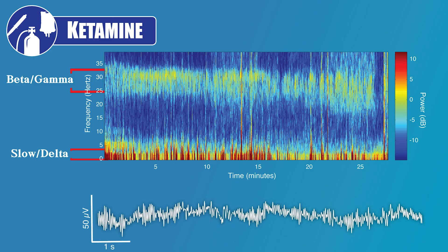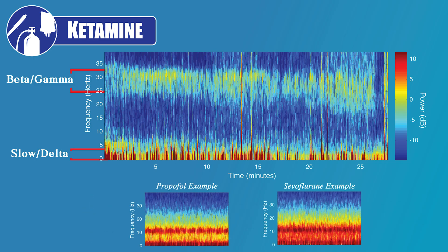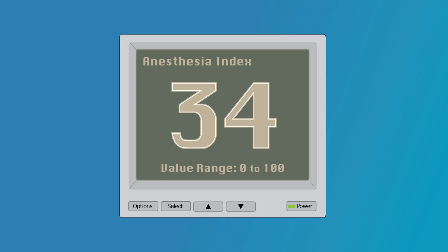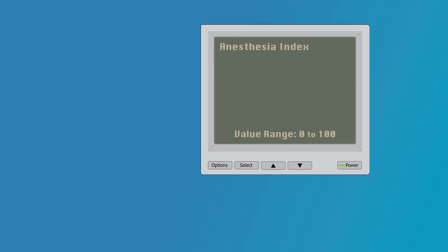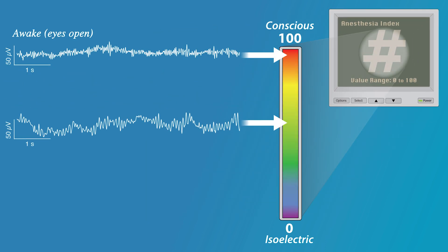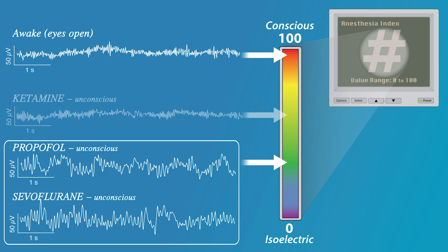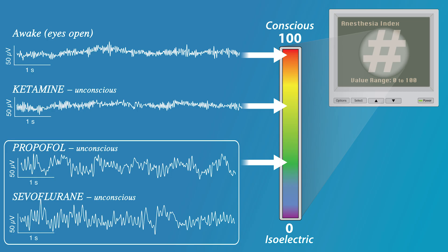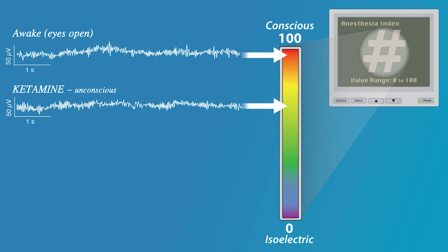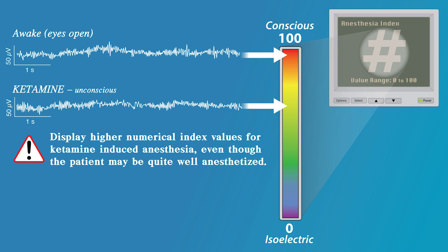A slow delta oscillation is also present in the EEG during low-dose ketamine delivery. However, compared to propofol and inhaled ether-derived anesthetics, this slow delta oscillation is less regular in appearance. Processed EEG-based depth-of-anesthesia indices tend to have problems when ketamine is administered. These indices tend to associate low-frequency EEG patterns with a more unconscious state. While this is true for drugs like propofol and sevoflurane, it is not true for ketamine. By the nature of how ketamine affects the brain, it produces high-frequency EEG activity when it is working to alter consciousness. The processed EEG depth-of-anesthesia monitors do not differentiate between drugs, so they tend to observe this 30 hertz activity and display higher numerical index values for ketamine-induced anesthesia, even though the patient may be quite well anesthetized.